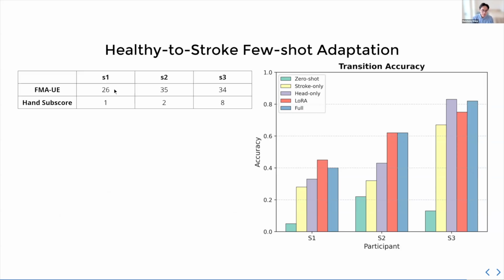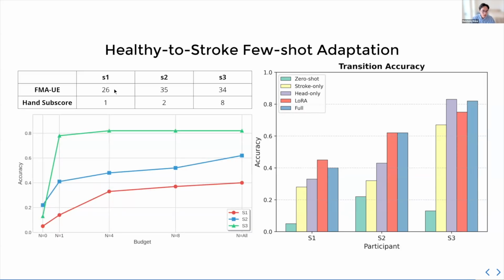And one other behavior we see is that if you consider the amount of samples you use, right? The extreme few shot setting where you only have one sample or 4 samples, 8 samples. So at one single sample, if you fine tune from healthy, it actually improves your performance by quite a bit, almost doubles than if you train from scratch. Which goes to say that these pre-trained weights are from healthy, which might have a different distribution than stroke, actually helps a lot with stroke adaptation.